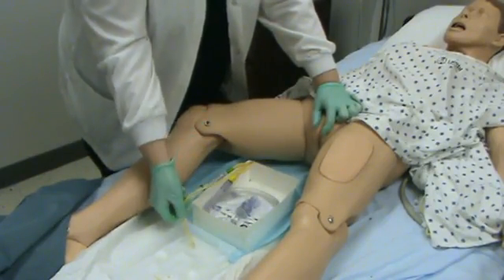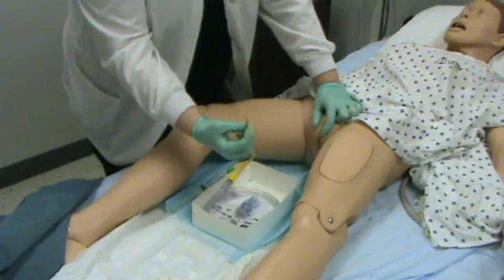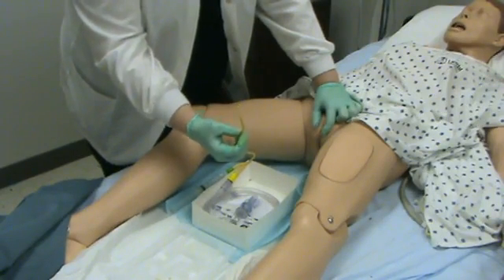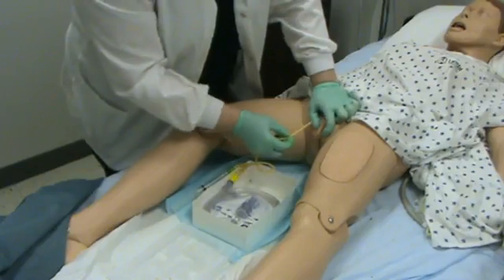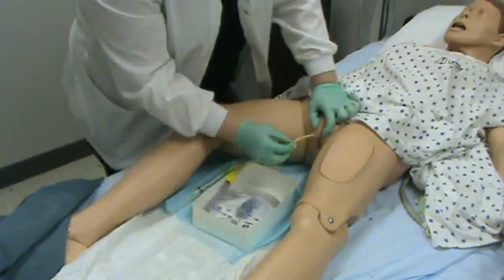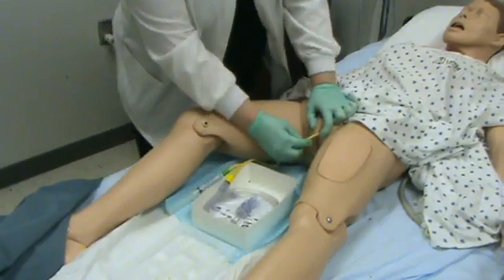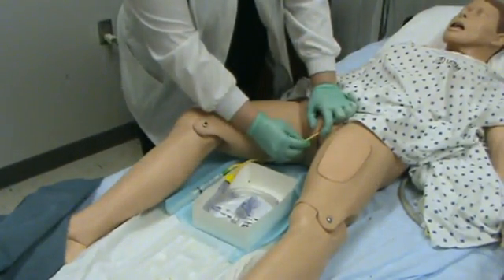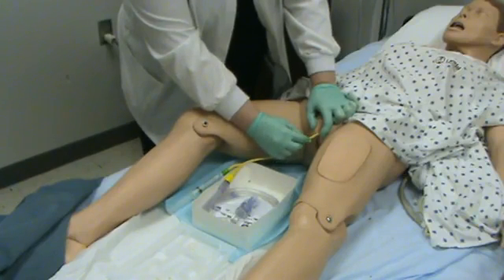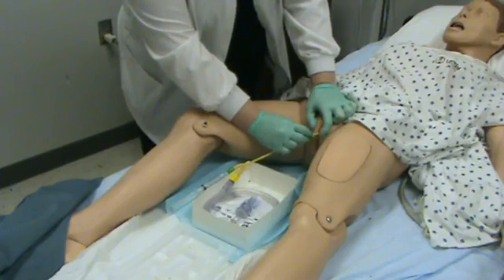Now I want to lubricate my catheter. The only thing I am concerned about is the first three to four inches and keeping things sterile. Once it is lubricated, I am going to put a little bit more lubrication on it. Insert the Foley catheter — with your sterile hand, you want to insert the catheter until you start seeing urine. Once you see urine, you would want to go in another inch.